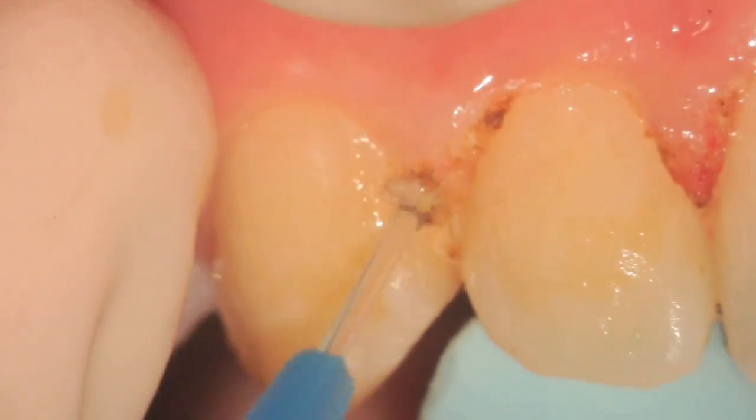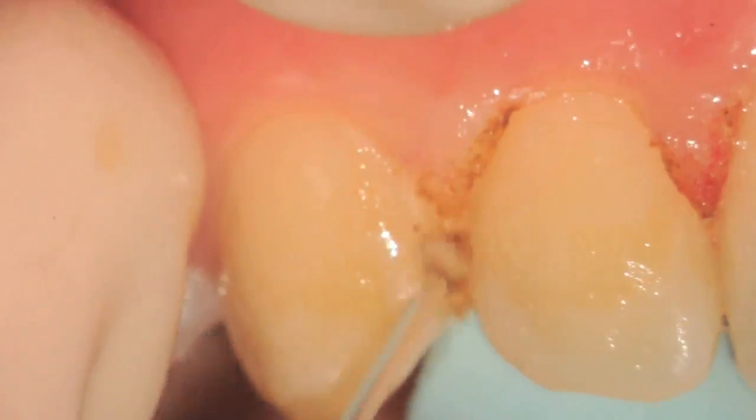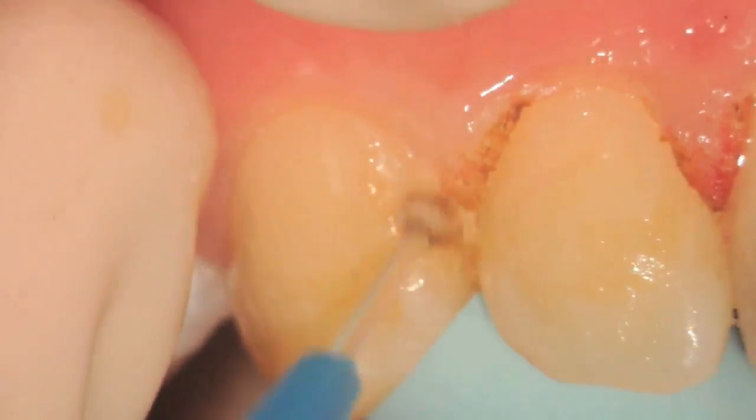Every time a little bit of debris builds up on the tip you need to remove it. You can see in this particular case we're a little bit slow in removing the debris that is building up on the tip.